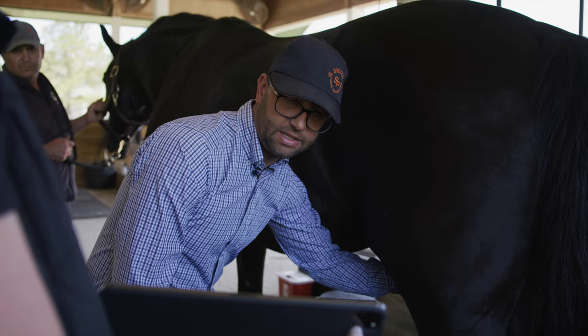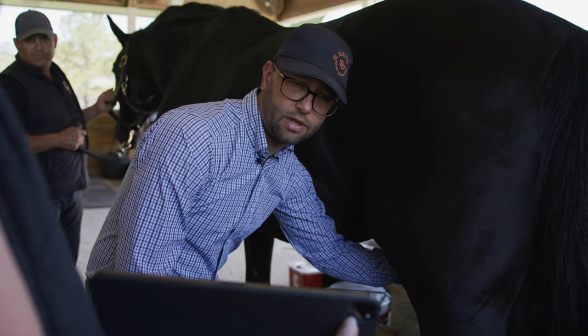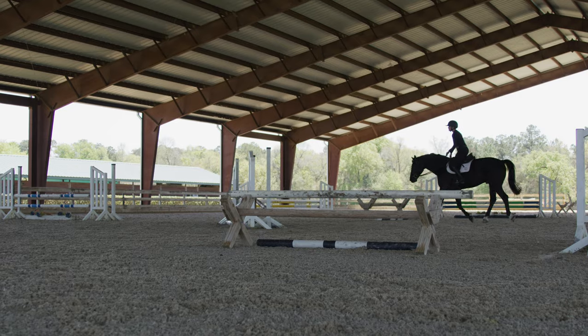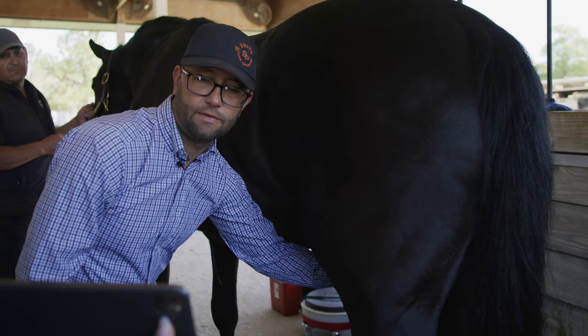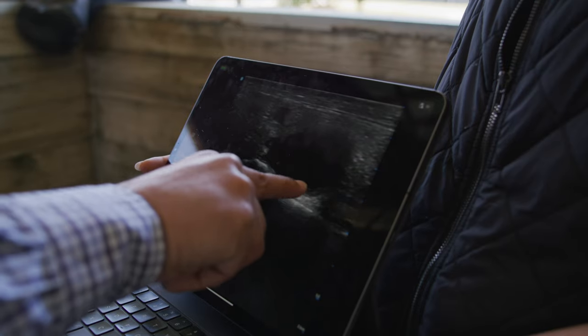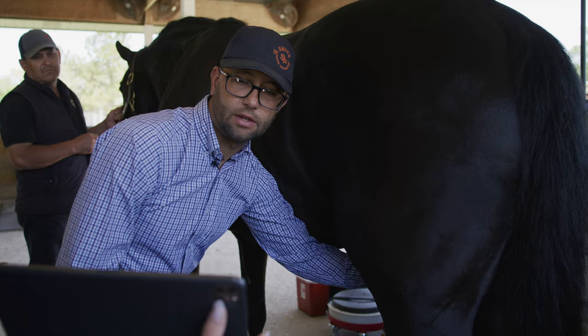I look at the consistency of the joint fluid — is it what I'd expect healthy joint fluid to look like on an ultrasound, or are there some signs of inflammation that are starting to return? It's basically like using an iPhone and taking a picture. It's very easy to store, send, and document what you're seeing on the exams.